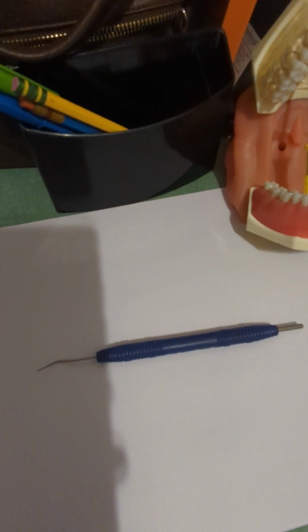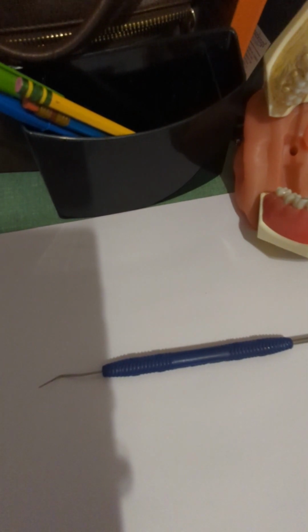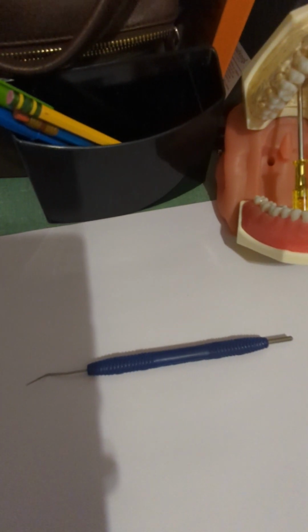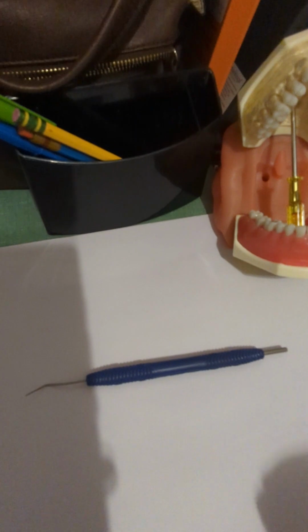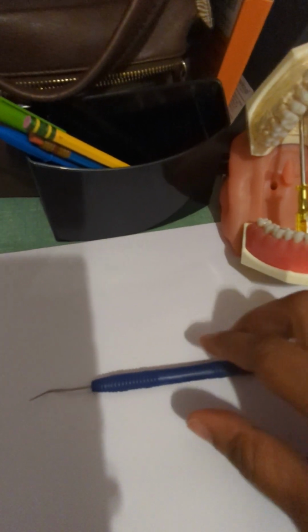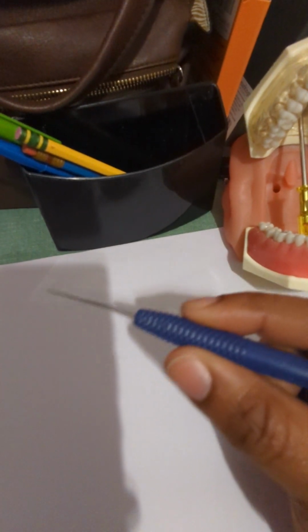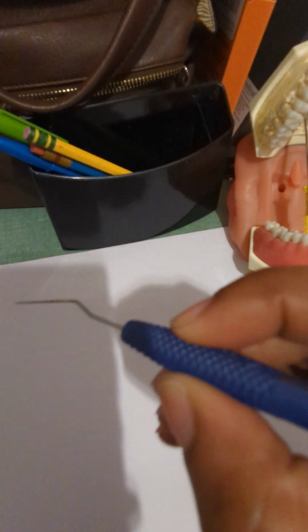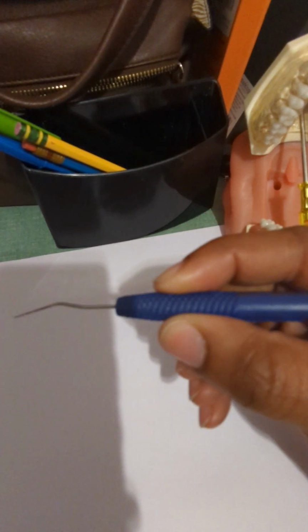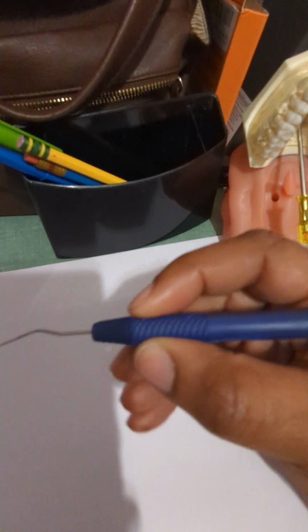Now that we are aware of the indications and contraindications for perioprobing, let's move on to holding the instrument, our grasp. Now, when you're holding the instrument, your index finger and your thumb are holding the handle, as you can see here.